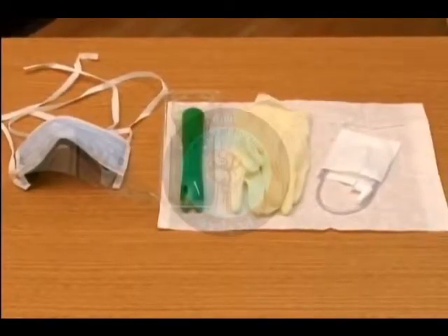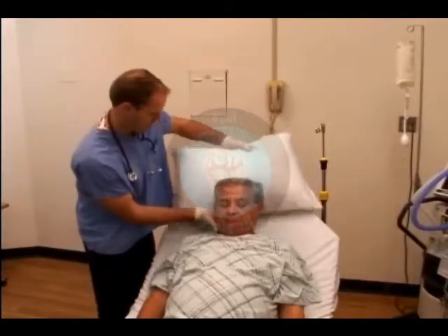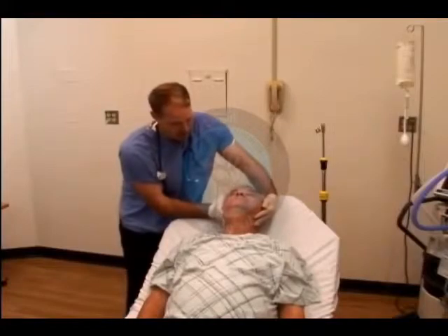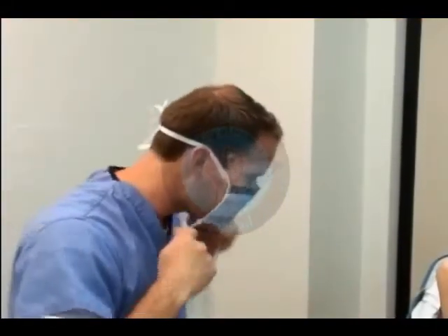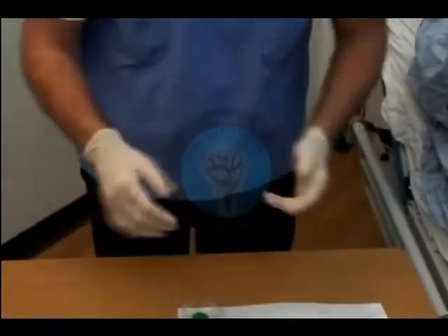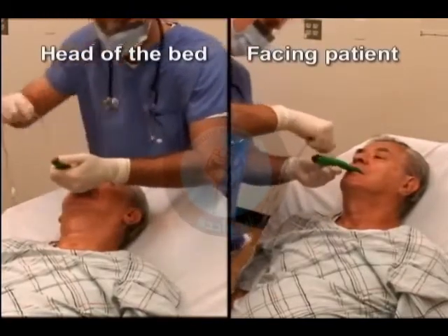Have your supplies ready. If your patient's condition is deemed appropriate, remove your patient's pillow and tilt the head back to facilitate opening of the airway. Put on your gloves and a mask with facial shield for your protection. Depending on your preference, you can either face the patient or stand at the head of the bed.